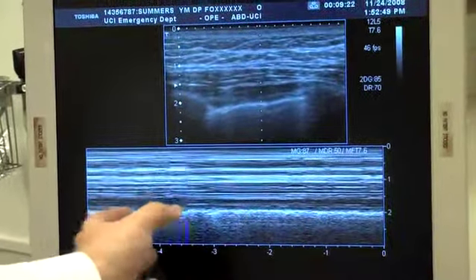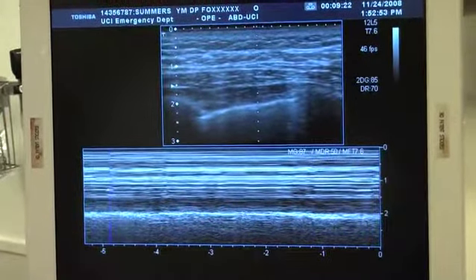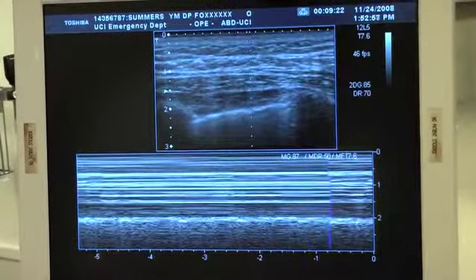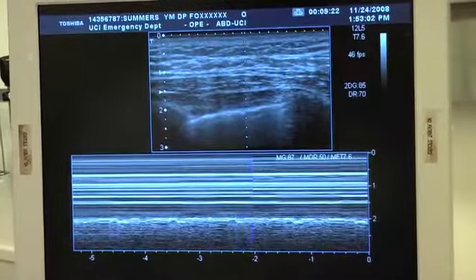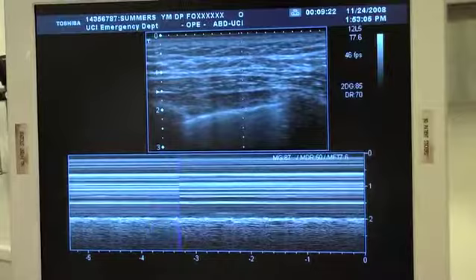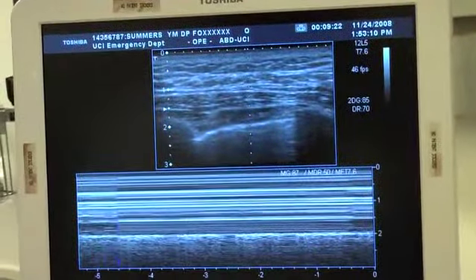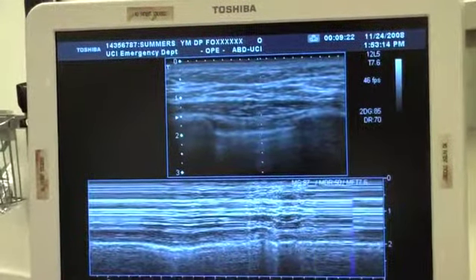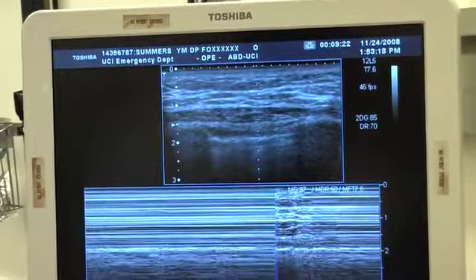Now she's going to hold her breath. Not move a muscle. Still a little bit of slight lung sliding there. Can you take a deep breath and hold it completely and then don't move? There. That's good. Perfect. Okay.